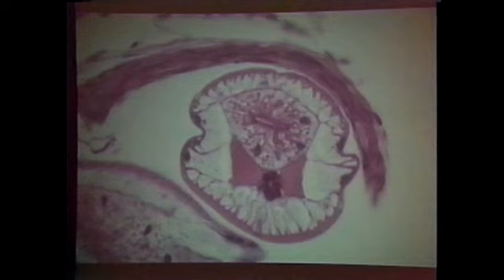The problem arises when you get ascarid larvae. It's very difficult to differentiate between ascarid larvae and spirurid larvae. The spirurids are another group of nematodes. The reason being is they have intestines that look somewhat alike, and they also have coelomyarian musculature. But these are different presentations of ascarid larvae.